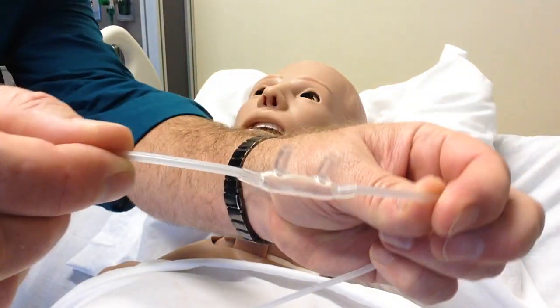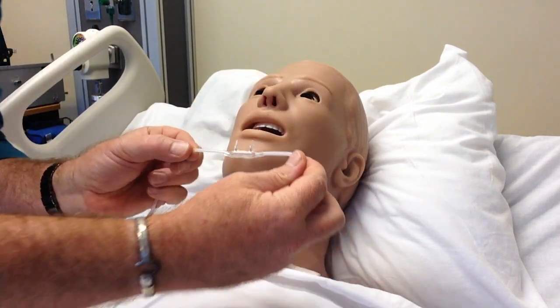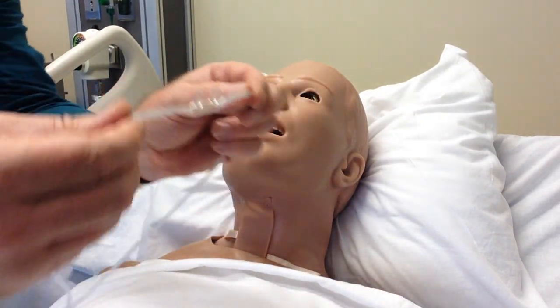Here is a nasal cannula. You can see it has a slight curve. That curve will go up and into the patient's nose.